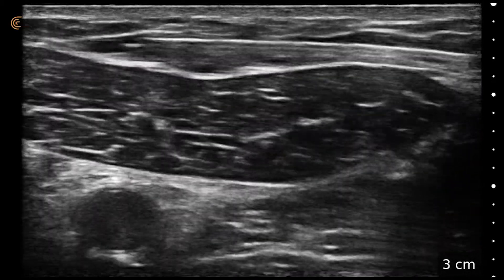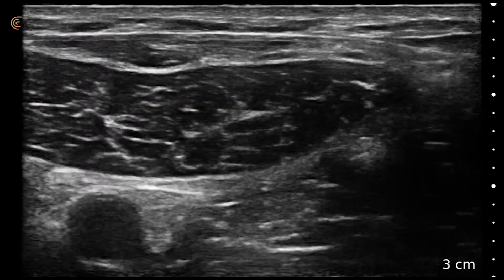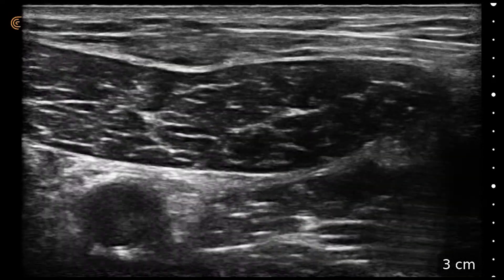So there we go. Real simple approach, real simple technique — pretty superficial on a guy that doesn't have a lot of body fat.